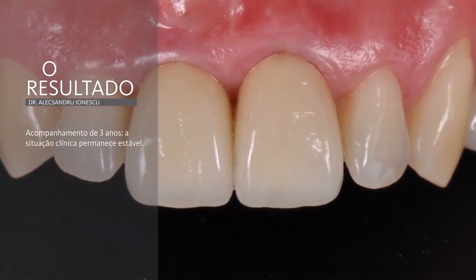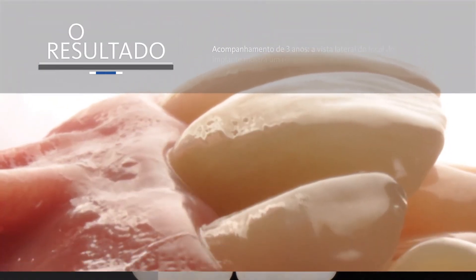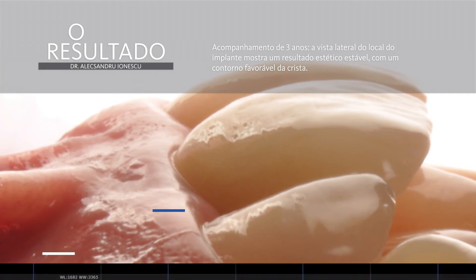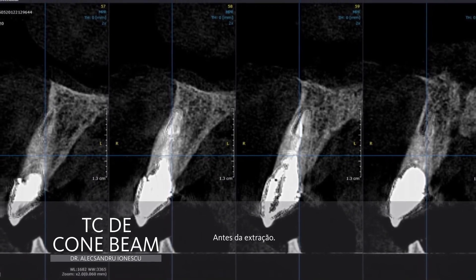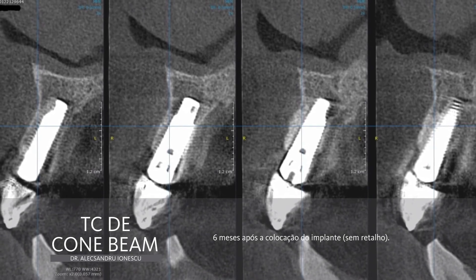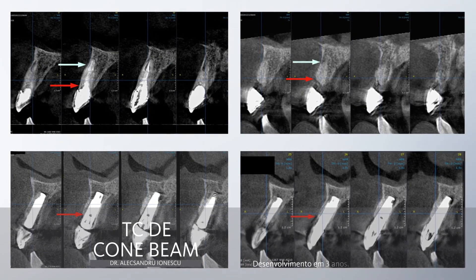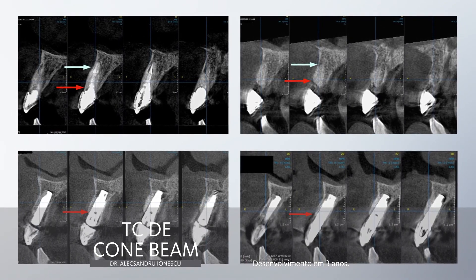Here is the 3-year follow-up showing a stable 3D architecture of the surrounding tissue. This is the lateral view at the implant site showing a stable aesthetic result with a favorable ridge contour. This is the CBCT imaging before extraction showing the root fracture, the CBCT imaging 6 months after flapless implant insertion, and the CBCT imaging at 3-year follow-up. The full overview of CBCT imaging confirms bone stability after the open healing protocol and flapless implant placement.